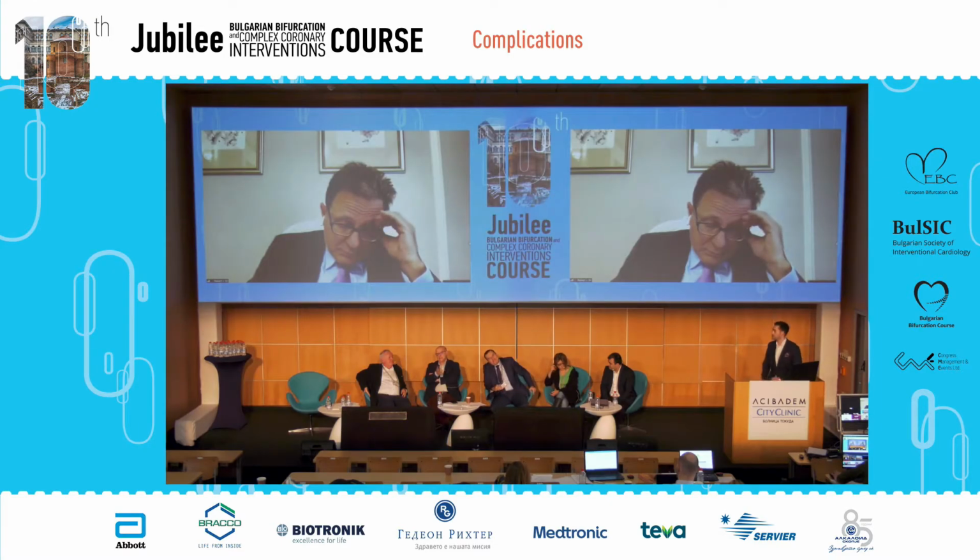We haven't recorded this, but the wire was already in the proximal part of the LAD. It went easily because the angle between the mammary and the LAD is not that sharp. If it's too sharp, it's very difficult to manipulate. But the problem will occur when you push material, when you put a microcatheter or balloon, probably it is going to straighten.